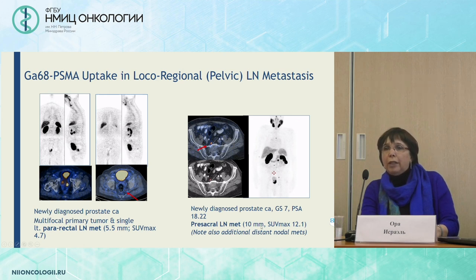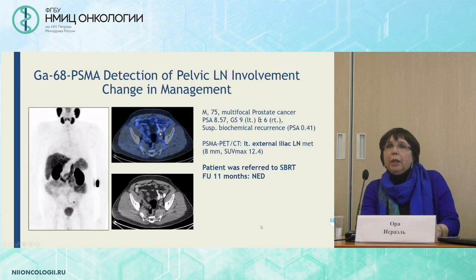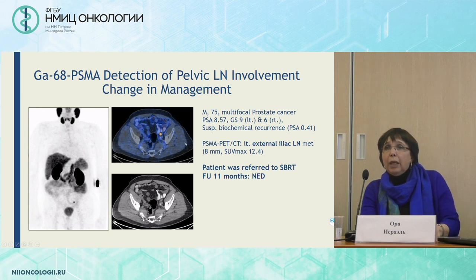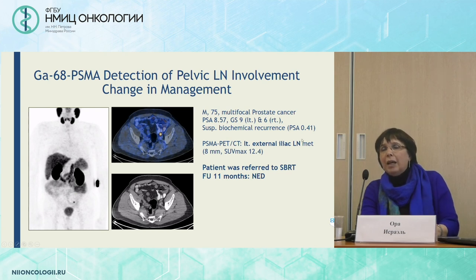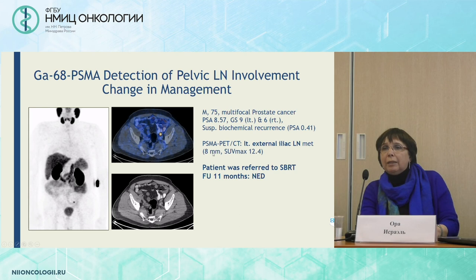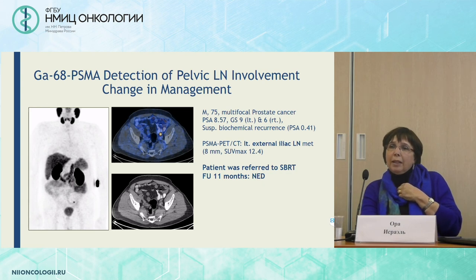You can see the size of all these metastatic lymph nodes. How does this impact patient management? In this patient who had multifocal prostate cancer with biochemical recurrence — PSA 0.41 — PSMA was the only modality to detect and localize a left external lymph node 8 mm in size. The patient was referred to radiotherapy, which was successful.